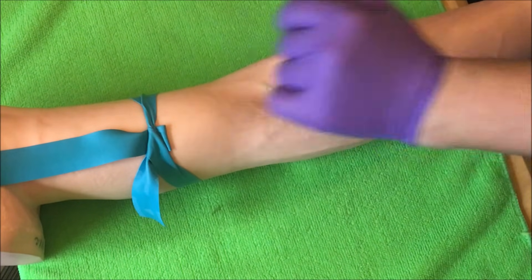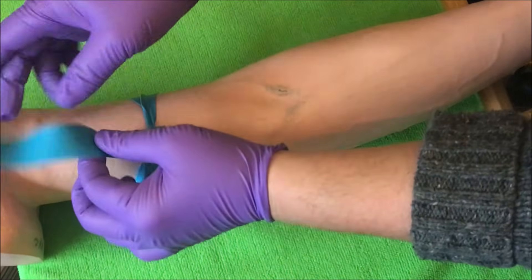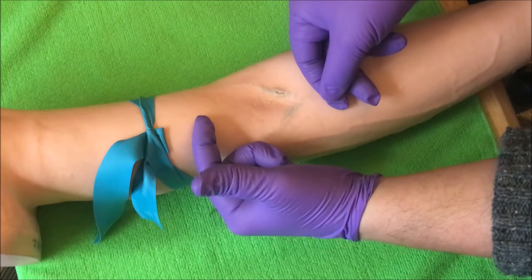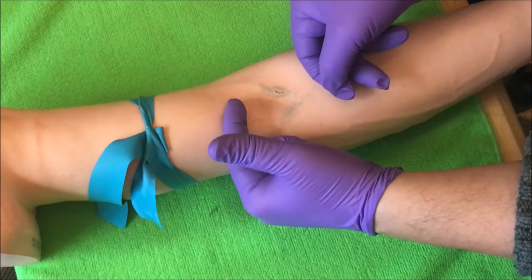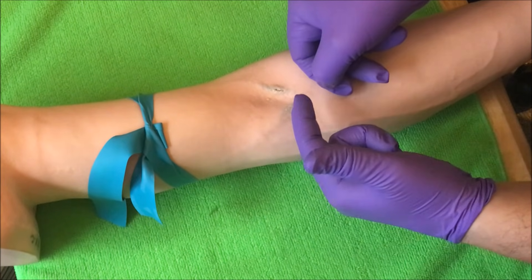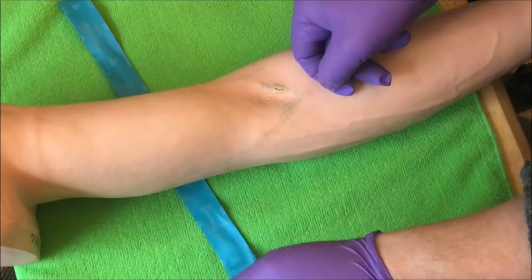So we want to go three to four inches above the site, no longer than one minute. Once I'm ready and done with the draw, I'm going to release the tourniquet. I don't like to pull back on the tourniquet when I have a needle in the arm — if you pull back, the skin can actually push back and the needle can come out. I've seen this happen with students many times. The skin pulls back, the needle comes out, falls right back on it, and it can cause irritation or pain and stop blood flow. So what I like to do is pull straight up or toward me to release the tourniquet.